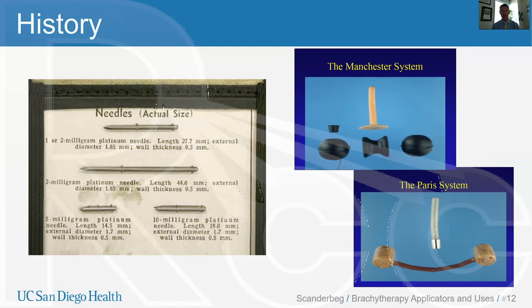It was also during this time that encapsulation techniques emerged that allowed for filtering of beta particles from the radioisotopes, and thus prevented high doses and tissue necrosis very close to the sources. Initially, radium needles were also used, as they were directly implanted into a patient. A radium needle is shown on the left, and the two pictures on the right show two very early applicators that, if you squint and use a little imagination, closely resemble our current tandem and ovoid type applicators.